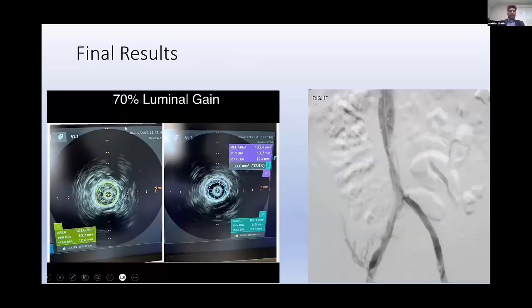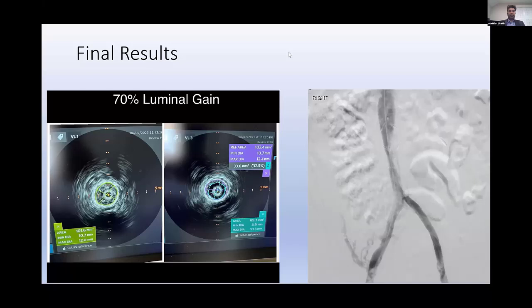These were the final results — the pre-image on the left and post-image on the right. IVUS showed a 70% luminal gain, going from essentially nothing to up to 70 millimeters squared. This is a very fresh case, and it's a staged approach. My stent looks much better than it did, and I now have flow through it. I still have work to do with the IVC, and I need to confirm patient compliance before returning to further reconstruct and possibly remove the filter as well.